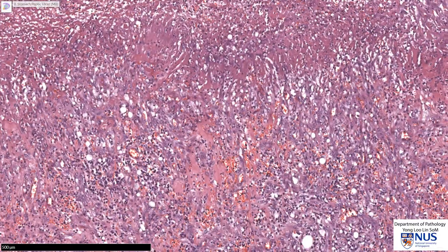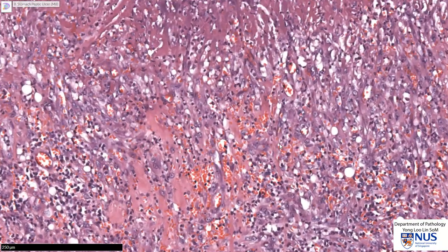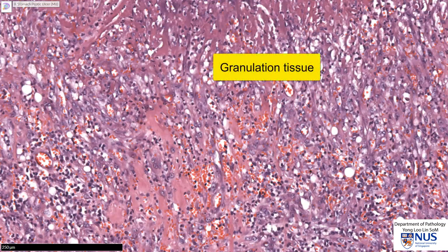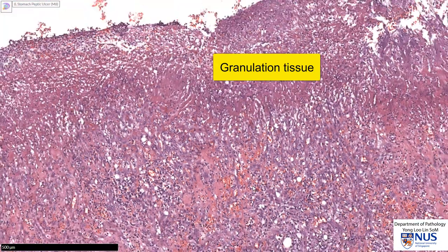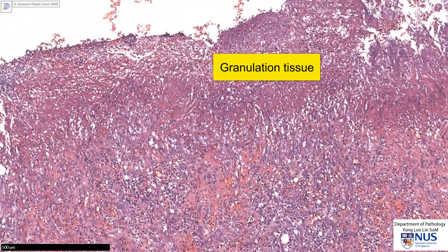Below that, we can see a lot of small blood vessels. These are all red blood cells located within the lumina of small newly formed blood vessels. And this is the zone of granulation tissue.